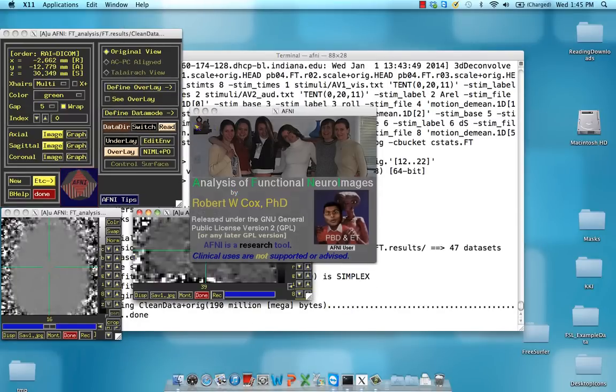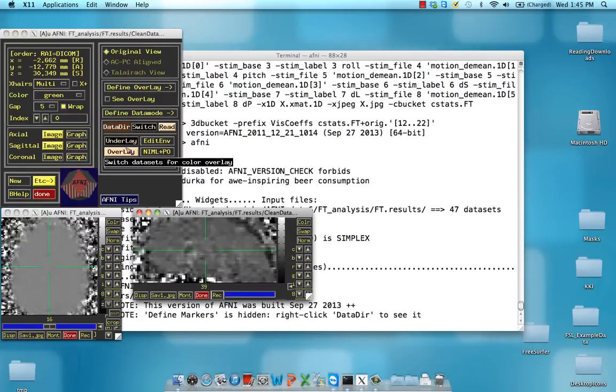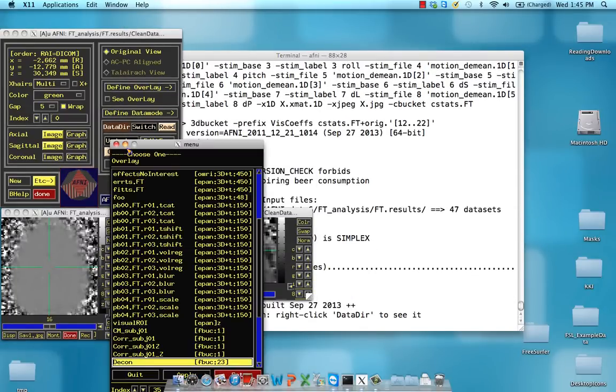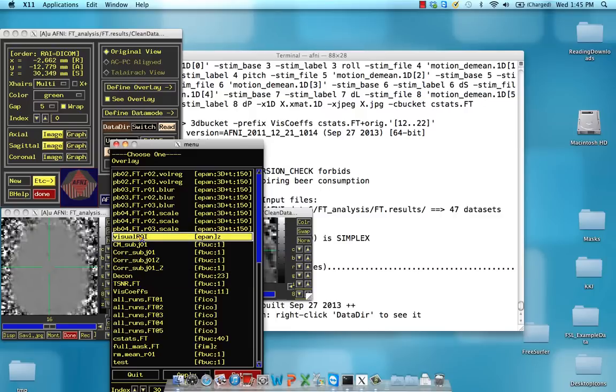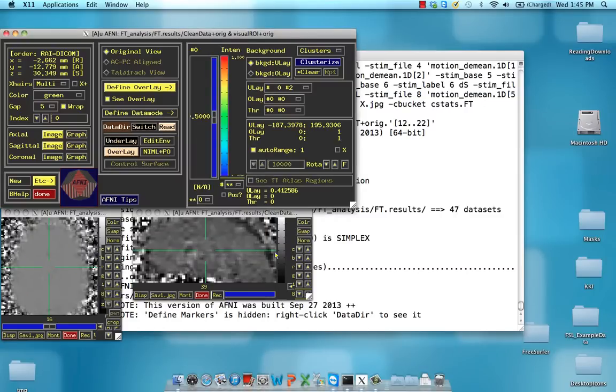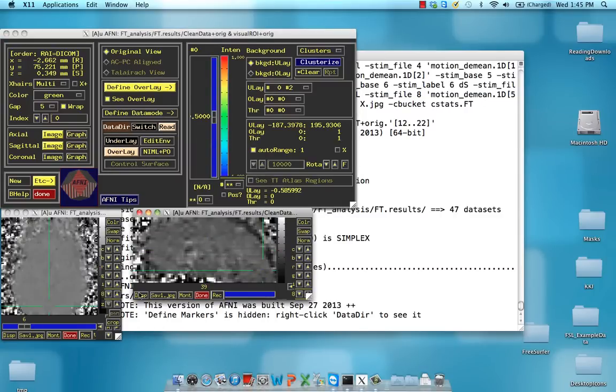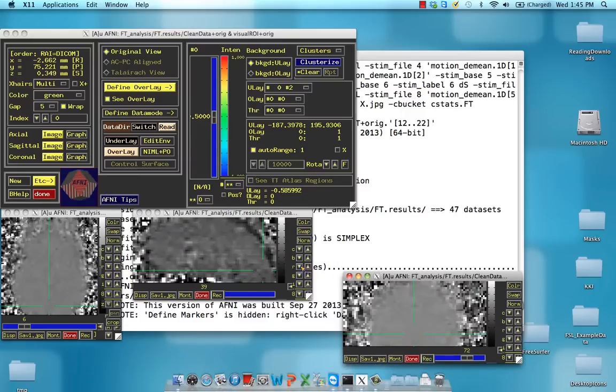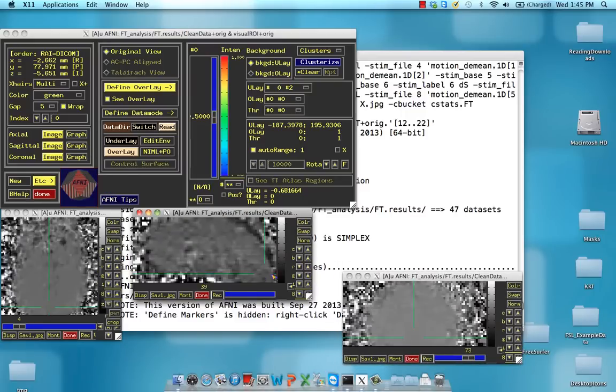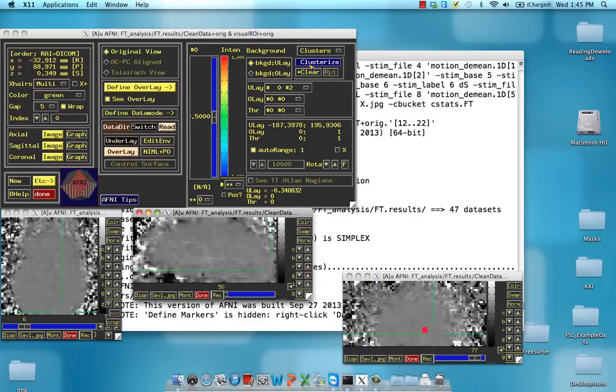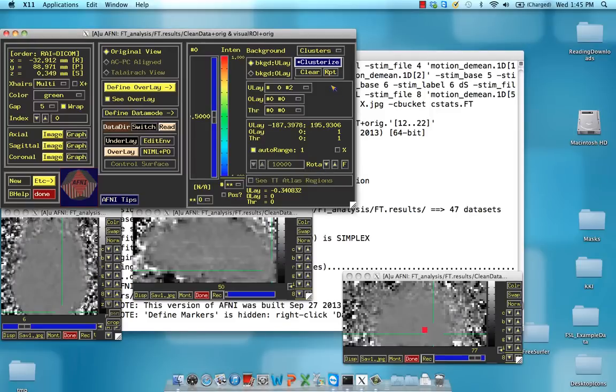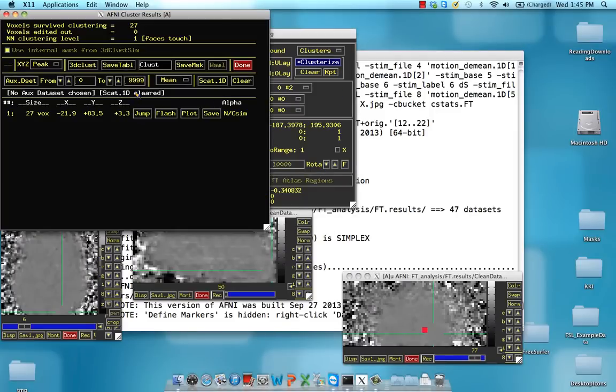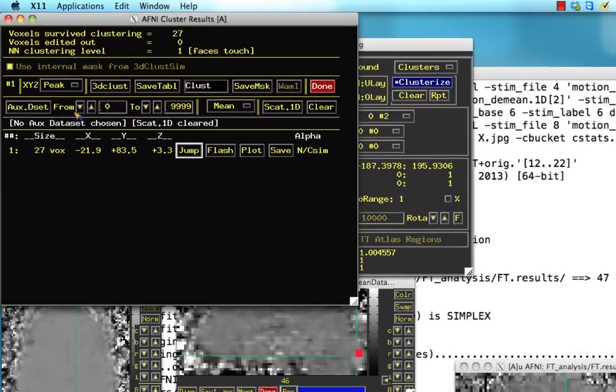I'm going to boot up AFNI here, and just for simplicity's sake I already have this visual ROI that I've created. It's way back in the brain, I know it's here somewhere. Trust me. We can lock onto it by using Clusterize reports and then just jump to that location.